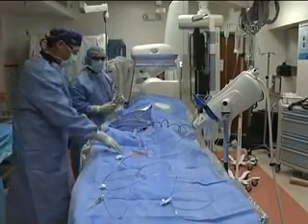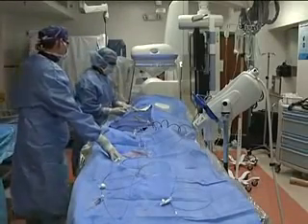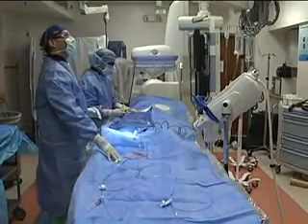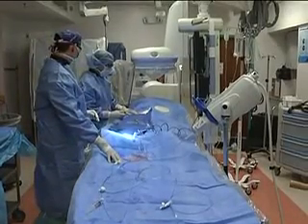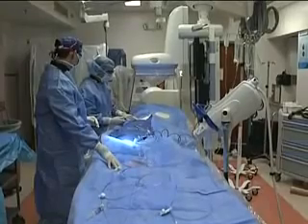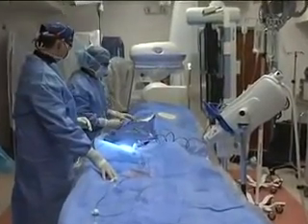This is a 57-year-old gentleman who presented with a non-ST segment elevation MI, continued chest discomfort, and rising troponins. He is here for a cardiac catheterization to investigate his coronary anatomy.